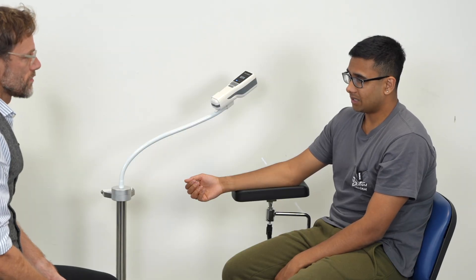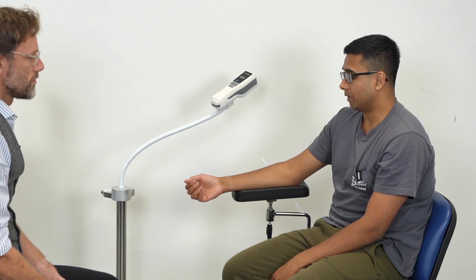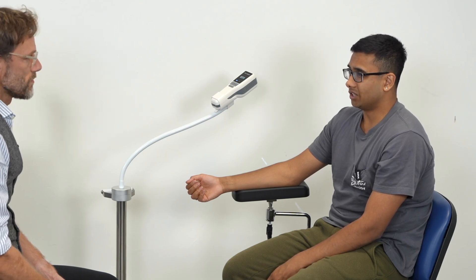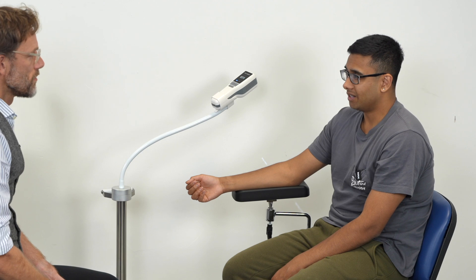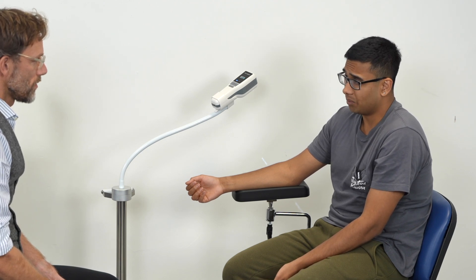I know I've been asked to have a blood test, and I'm happy to have the blood test. But in the past, it's been a problem for people trying to find my veins. Having a blood test is quite discomforting anyway, and it's not the most pleasant experience. So I'm kind of anxious about it all, but I've heard there's a piece of kit that could help.